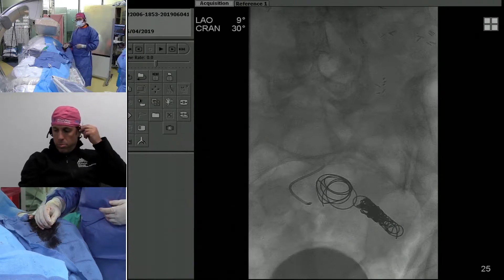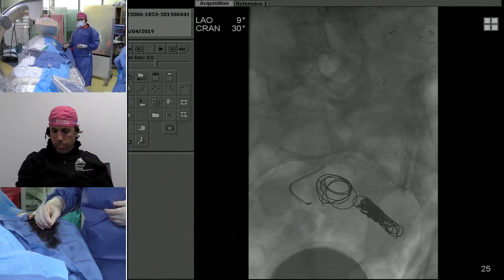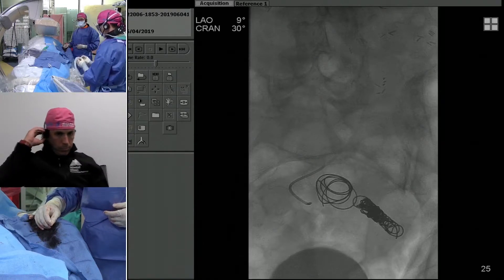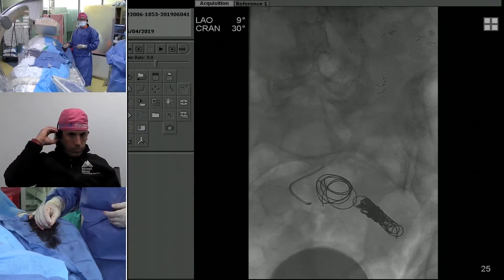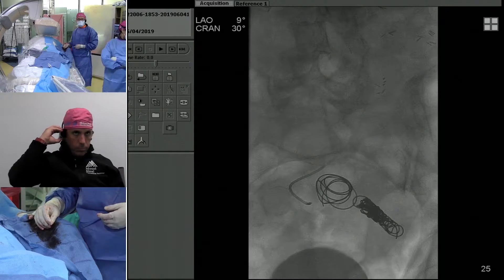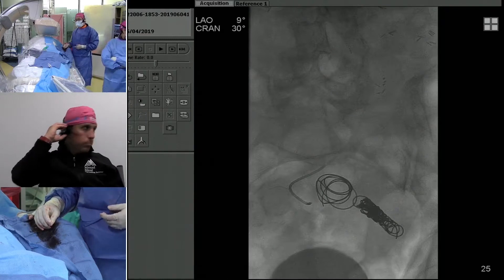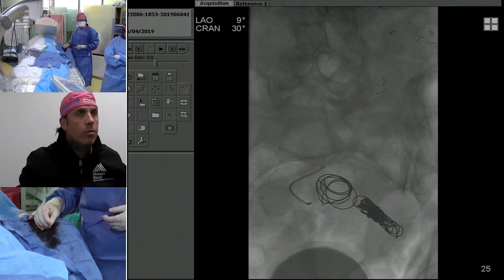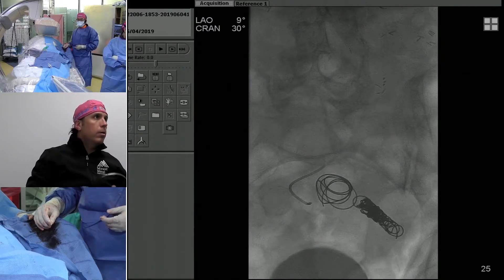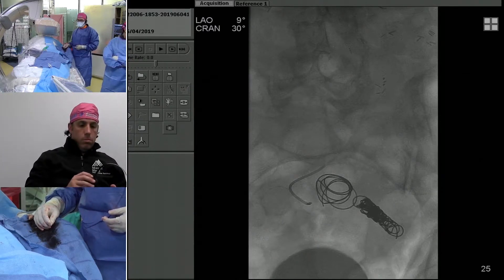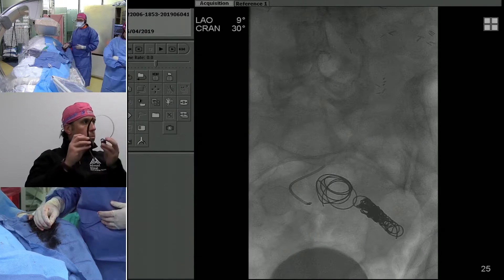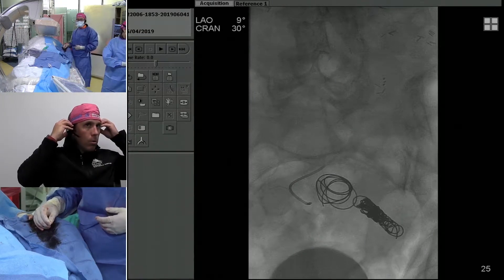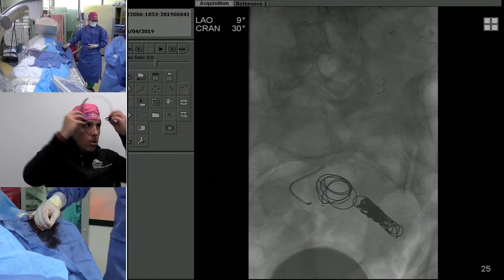For stability — if you're going to switch, can you leave an O14 buddy wire and then just coil next to it with the O18 system? That's a great idea. One option was to start with the O18 system, even from an O14 system from the get-go; I think that would have given a little more stability. But here we have the O35 catheter, so we'll continue. If we do lose stability, like you suggested, that's a great option.